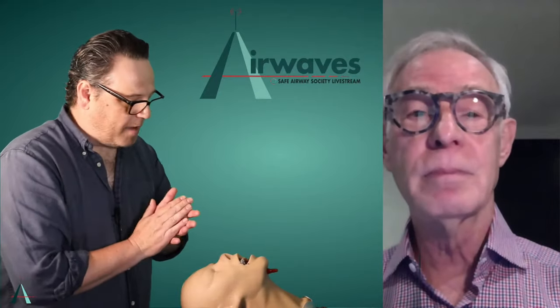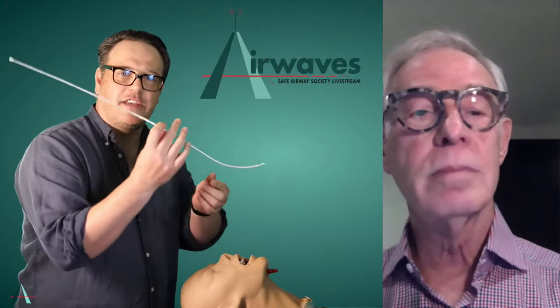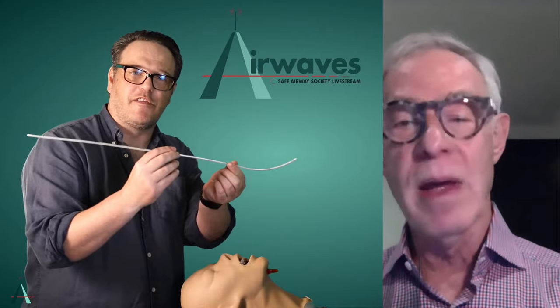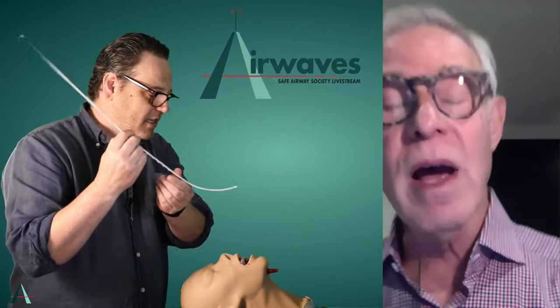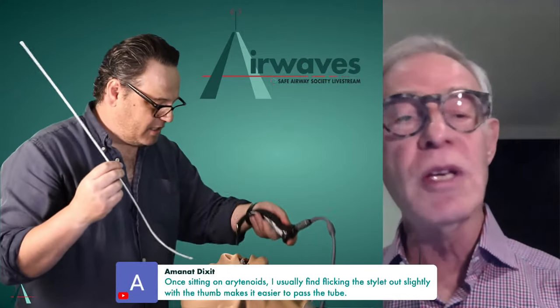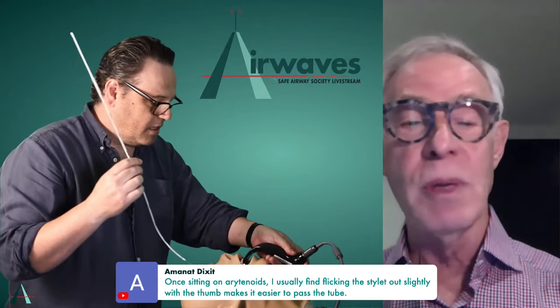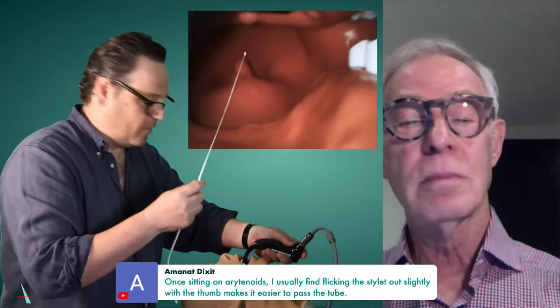Yeah. I just wanted to show you a couple of other things. I don't know if you've seen this device. This is something we have. Have you seen this? This is a curved bougie with a steerable tip. I have. I haven't used it. I've seen it in the literature. I don't think it's available in North America, but I could be wrong. I'm not sure. I'll just show you with this. And this is quite a nice device too.